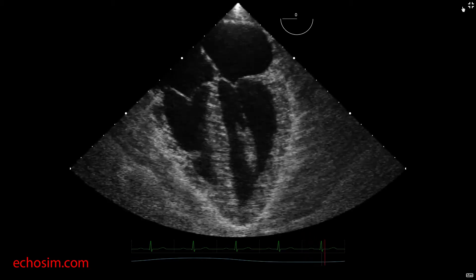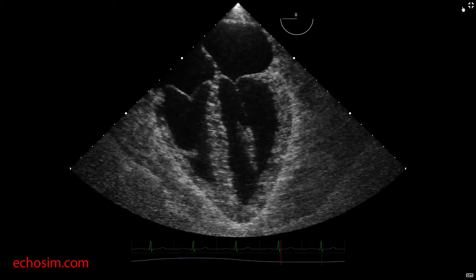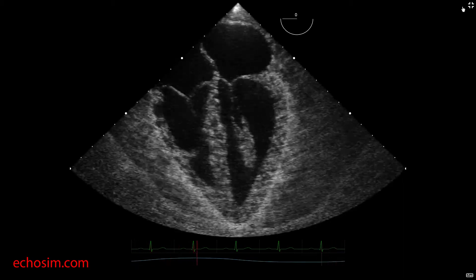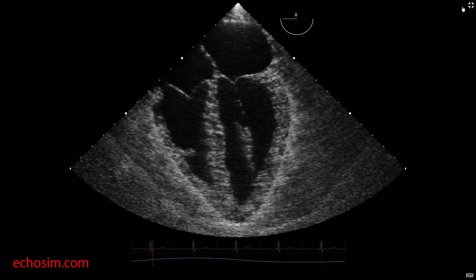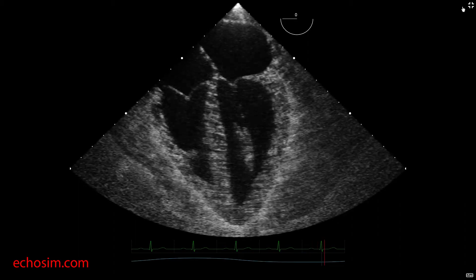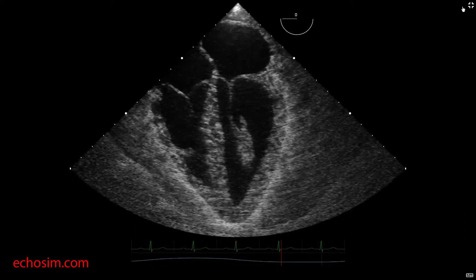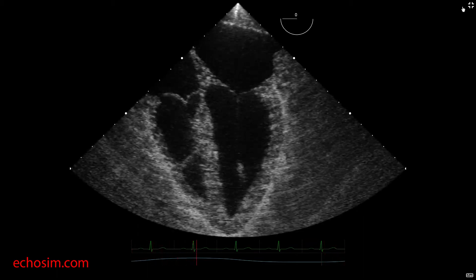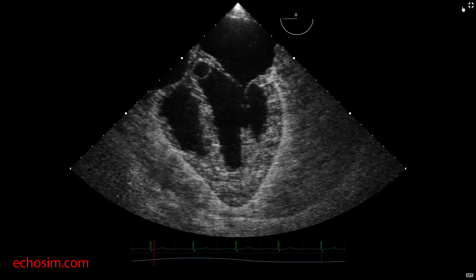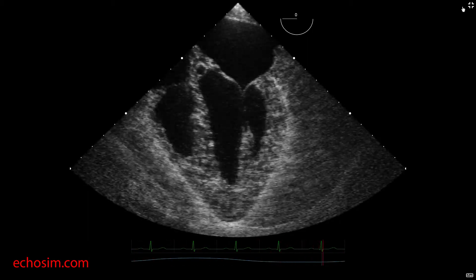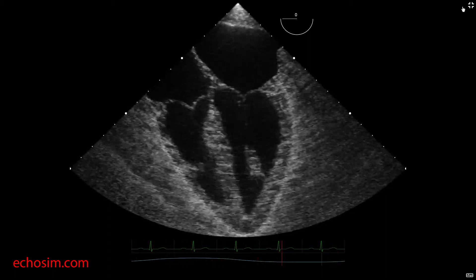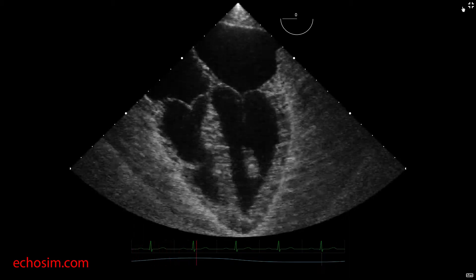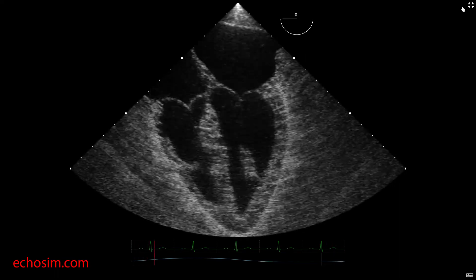While the correct degree of probe retroflexion will cause the apex to appear stationary, it will simultaneously cause the left atrium to be transected at a more caudal level, below its maximal diameter. This foreshortened cut through the lower part of the left atrium can be corrected by slight withdrawal of the probe. If withdrawal causes the left ventricle to be transected slightly above the apex — appreciated by a reduction in LV size and recurrence of apical excursion — it can be offset by further increase in probe tip retroflexion. These steps can be repeated as needed.